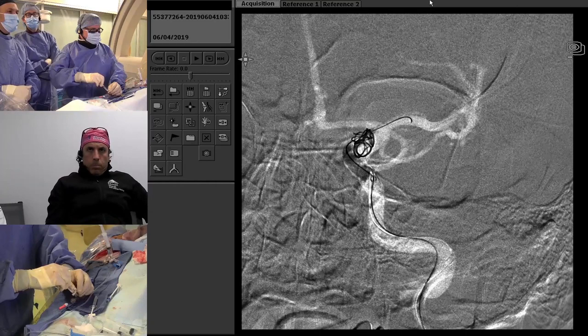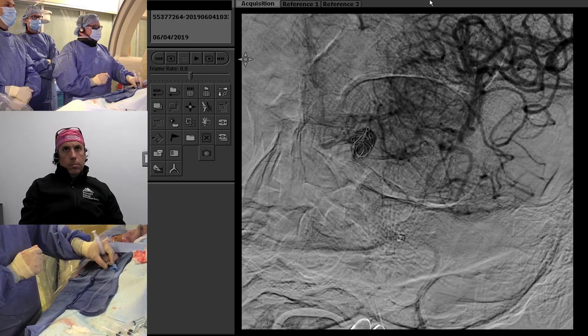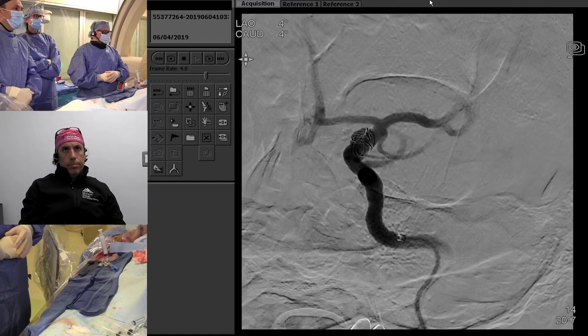You can see there is now some stasis in the aneurysm sac — that's great, from the flow diversion. And that's it — aneurysm treated. We'll do a final head run to make sure there's no distal emboli or any issues, then pull out and put on a TR band.